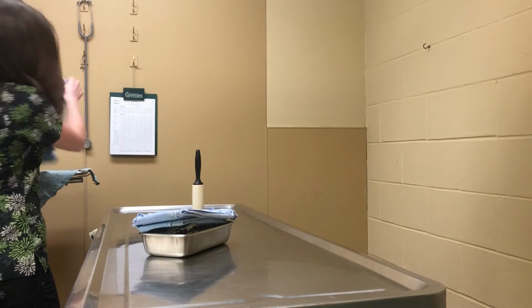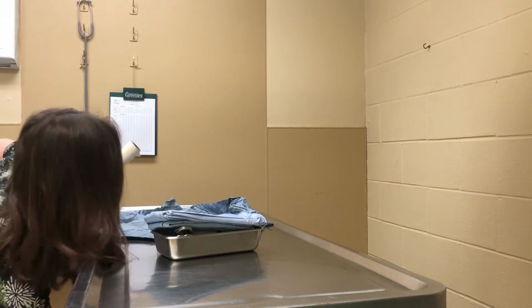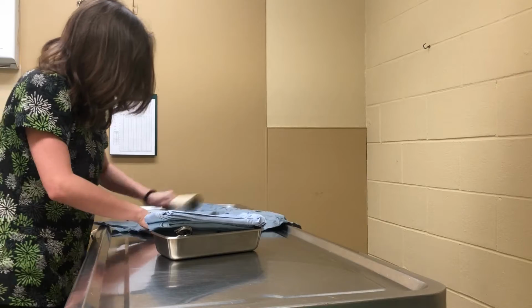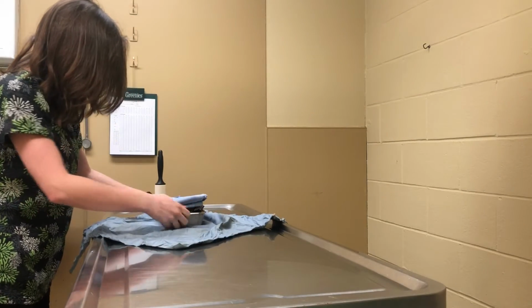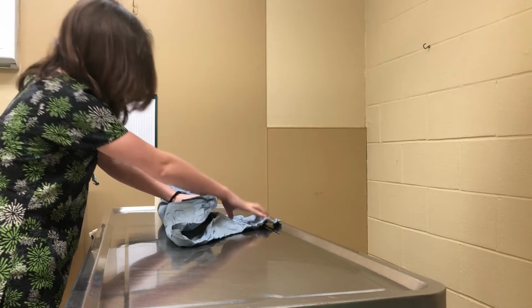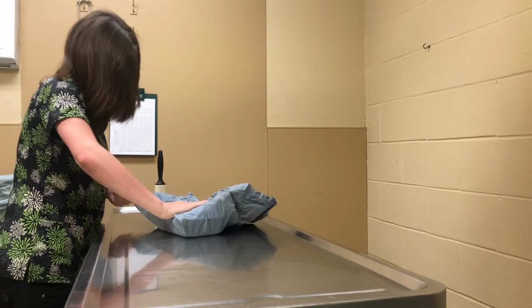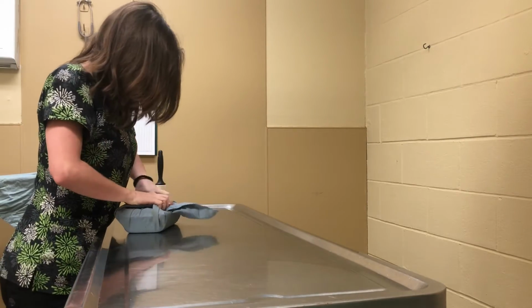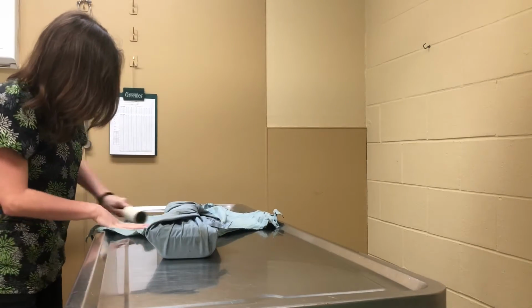So now we're going to go ahead and wrap it. Just like the gown, I'm going to take my lint roller and just get rid of any excess debris on my first wrap. Put my pack in the middle and bring my first corner over, and then make a triangle with it in an accordion manner and pull everything tight. Do the same with the other 3 corners. And then that last corner I'm going to tuck in. And then I will do the same thing with our outer wrap.